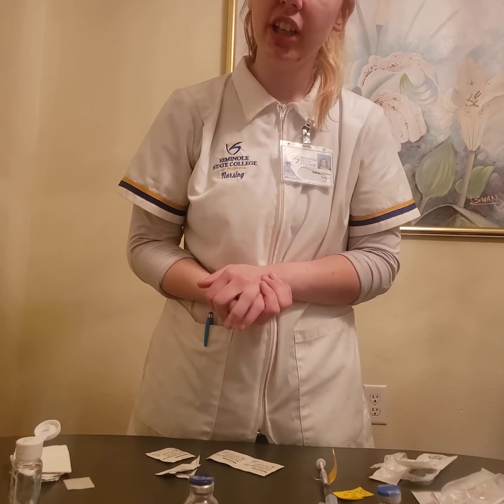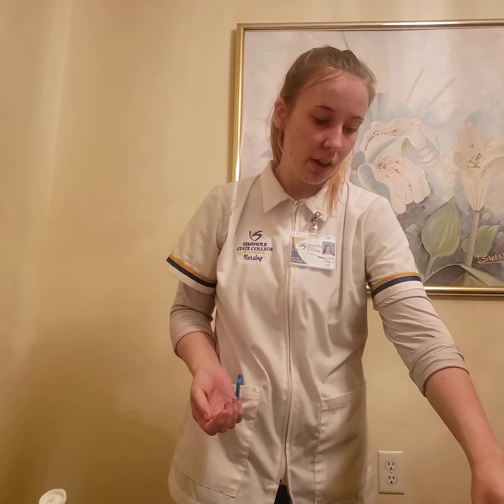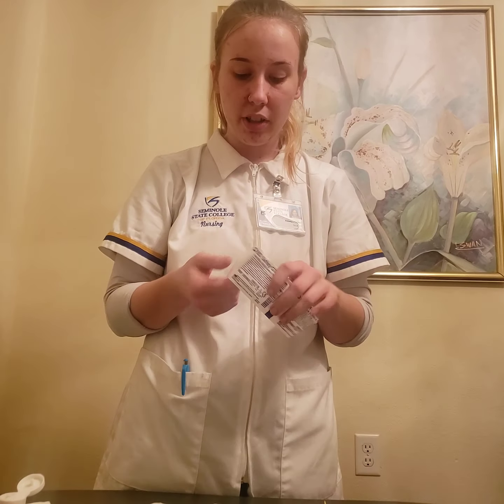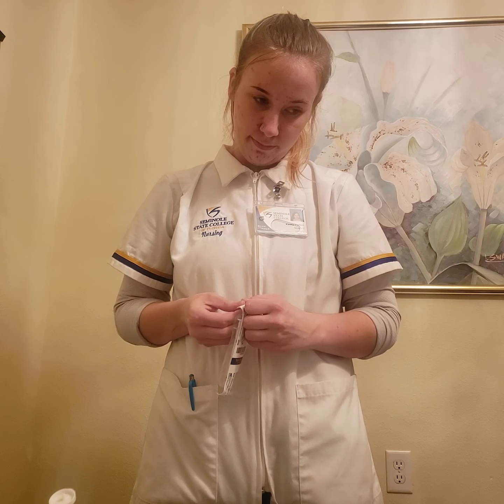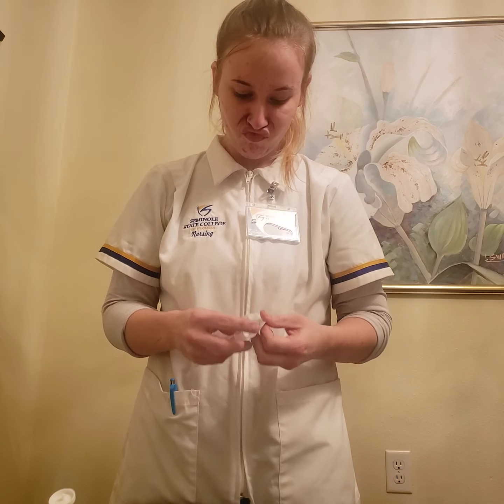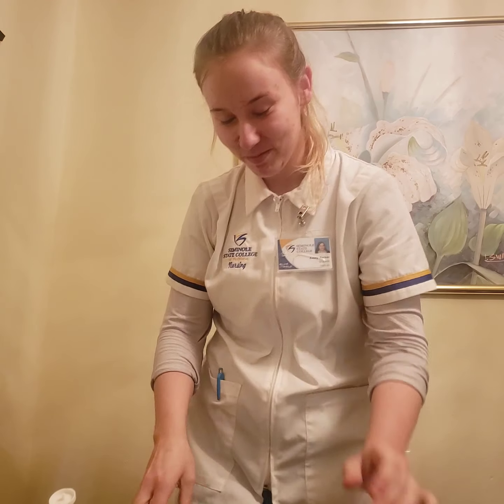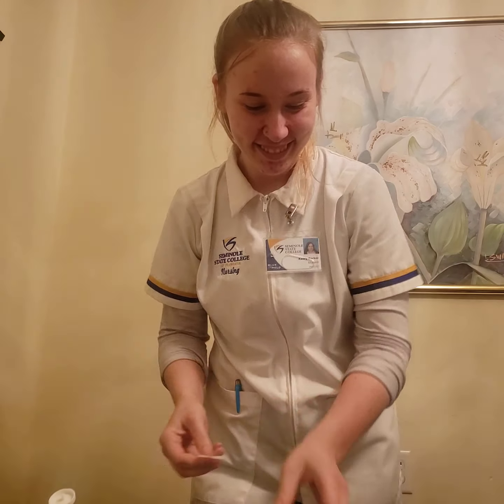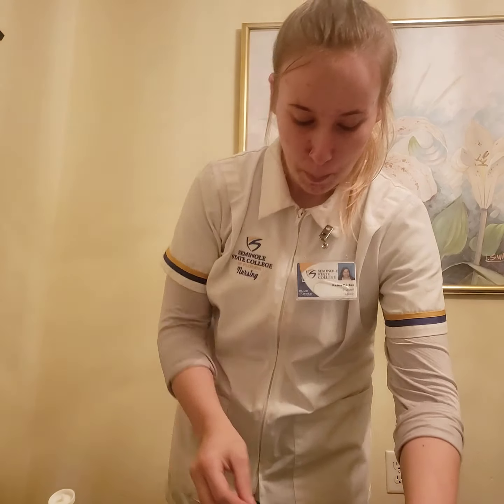Next I have my subcutaneous injection, which is going to be the cyanocobalamin, which is going to be the B12. I'm going to be using my 1 ml syringe, and it's going to be a 25 gauge needle, and it's 5/8 inches long. We're going to clean the vial first. We're going to scrub the hub of that with alcohol. And we're going to have to let that air dry.